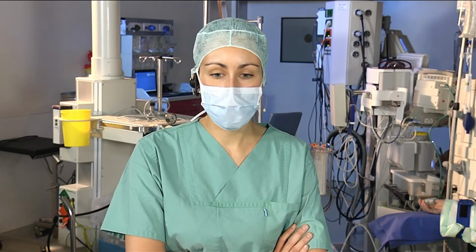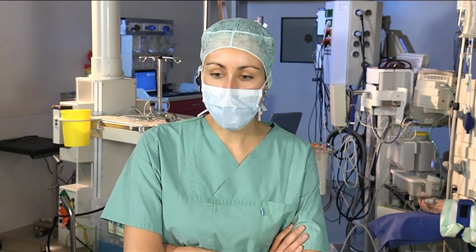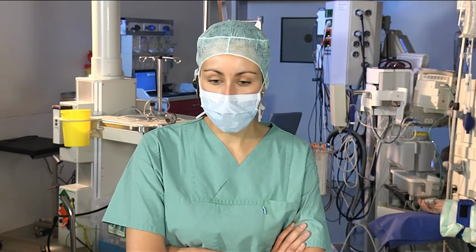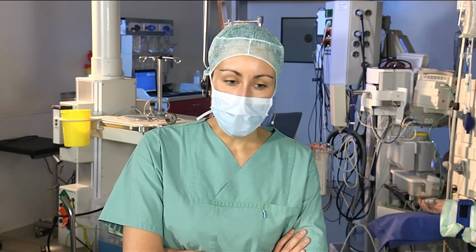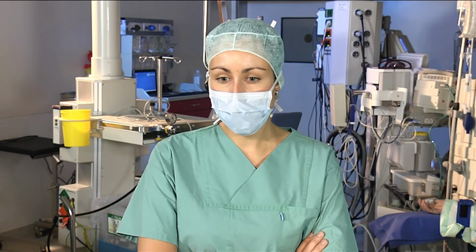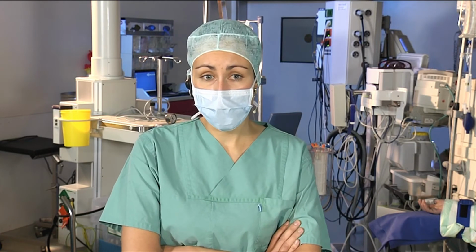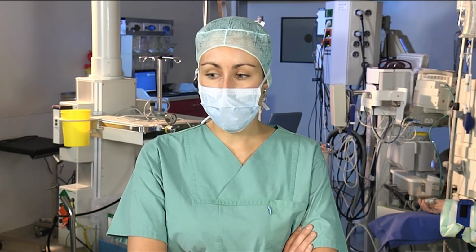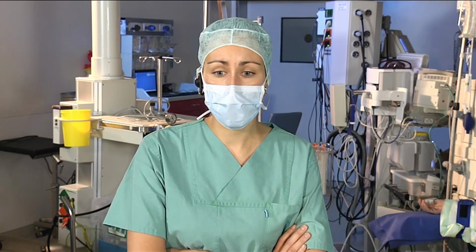Not in this case, no, because we knew from our previous CT scan that there were not so many intercostal arteries going from the false lumen. There were mainly intercostal arteries also not in the section we were occluding in this procedure. So we didn't worry about that too much, but of course we paid attention to a good mean arterial pressure after the procedure for the patient.